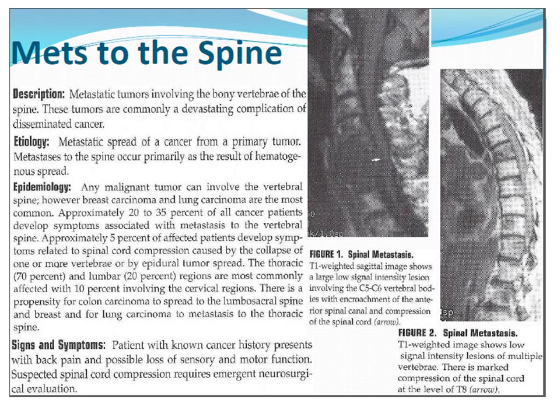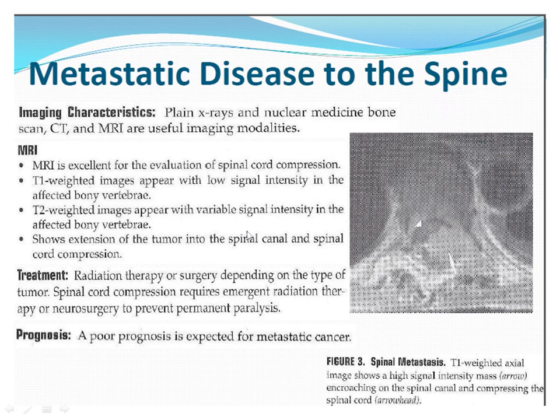So keep an eye out for the lesions to see if there's anything worth giving contrast for, if it hasn't already been ordered, and also for any signs of cord compromise. We want to take action on that before the patient leaves. Start talking to the doctor and come up with a plan. The patients may end up going straight to neurosurgery from your scanner.